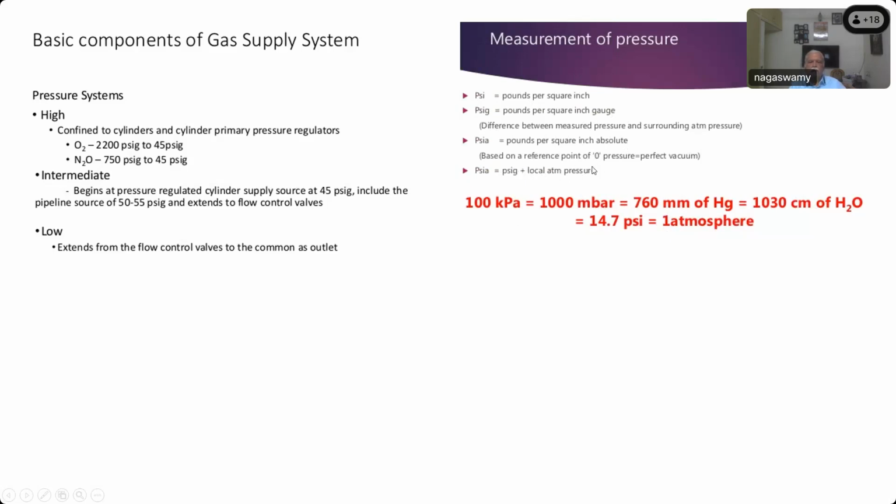Why is the word local atmospheric pressure added here? Adjusted to high altitude, sure. Fantastic. It is between sea level and higher level. So if you go to a hill station and use the same machine, the ambient pressure will be much lower. So you have to know that and use the words local atmospheric pressure.